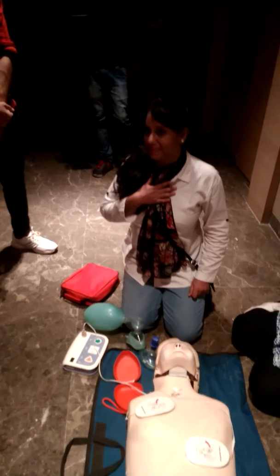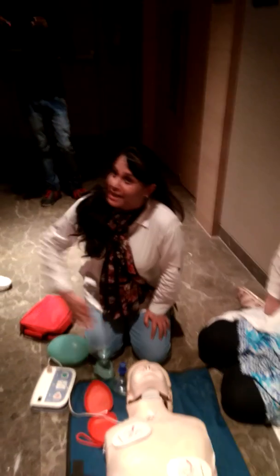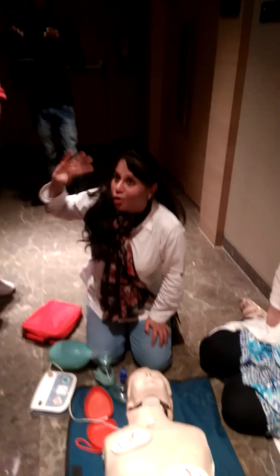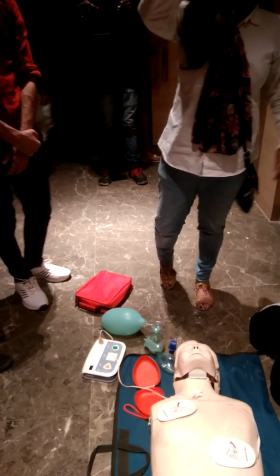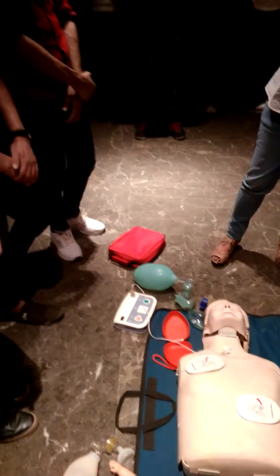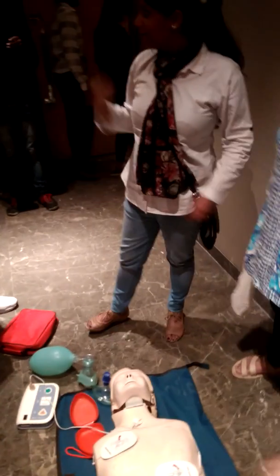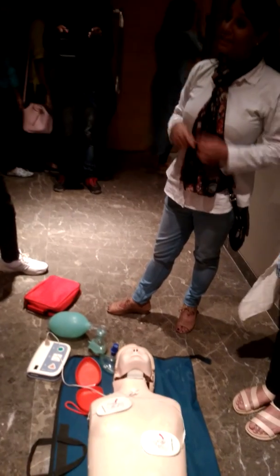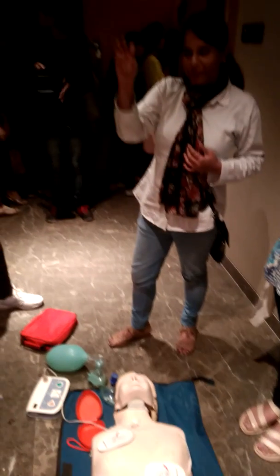When cardiac arrest happens and the heart stops, there are 4 possibilities in the heart rhythm on ECG. Either there is a straight line — a flat line, as you may have seen in movies. Or there can be ventricular fibrillation — ventricular fibrillation means the heart is contracting in a chaotic, disorganized way.